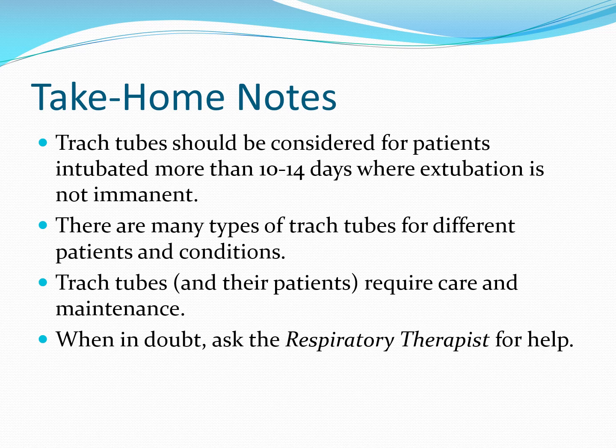So coming down the home stretch here, I'm just trying to take some of the key themes that we've gone over in the past 45 or 50 minutes. The trach tube should be considered for patients intubated more than about 10 to 14 days, and where extubation is not imminent. Many types of trach tubes for different patients in different clinical situations.